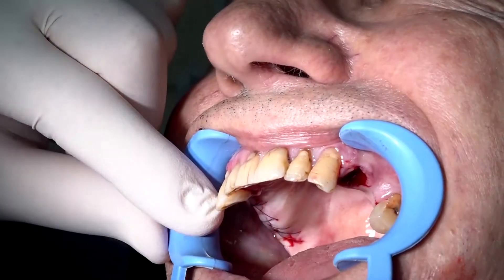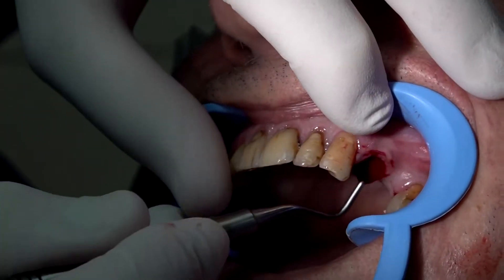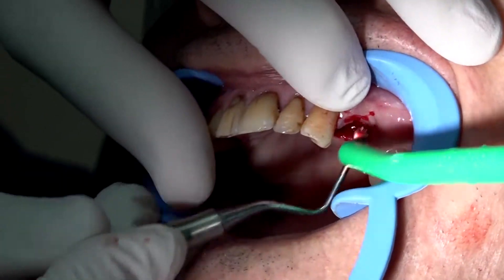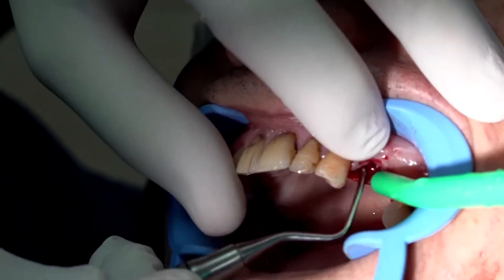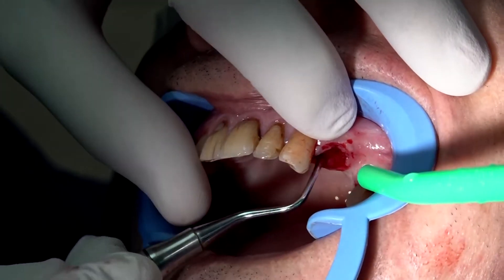In this case, after extraction, the graft will be left exposed. However, it will be protected by AuraAid, which is an adhesive band that resorbs completely from polymer, and we place it only as a surface protector in order that the material will not wash out.